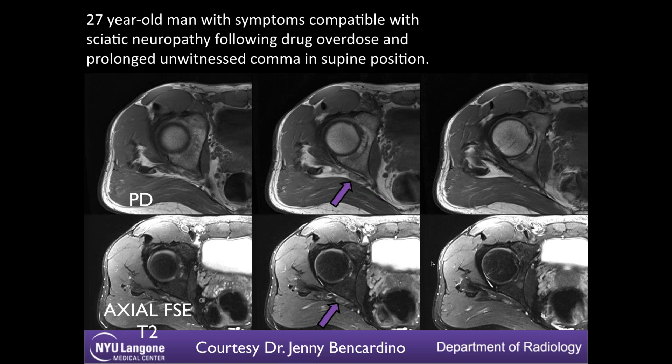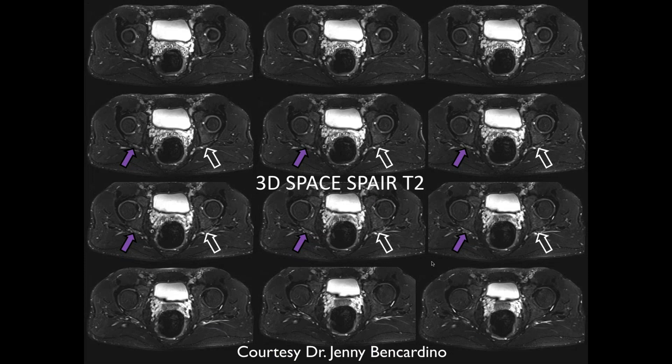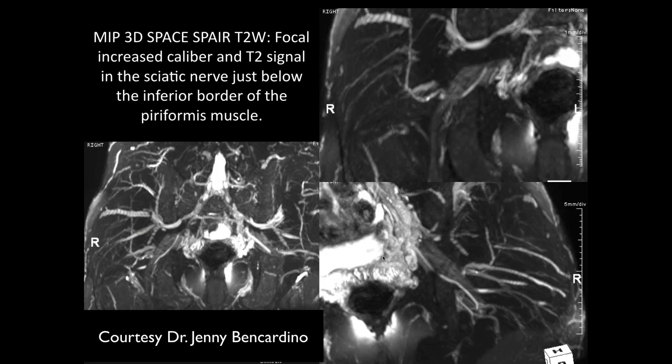Next case: 27-year-old man with symptoms compatible with sciatic neuropathy following drug overdose and prolonged unwitnessed coma in supine position. We have PD and axial images here. The arrow is pointing to what appears to be a thickened, edematous sciatic nerve. On a larger field of view, the arrow is showing the sciatic nerve which is a little more thick and hyperintense than on the other side. On the MIP 3D SPACE T2, there is increased caliber and T2 signal on the sciatic nerve — asymmetrically enlarged and thickened.